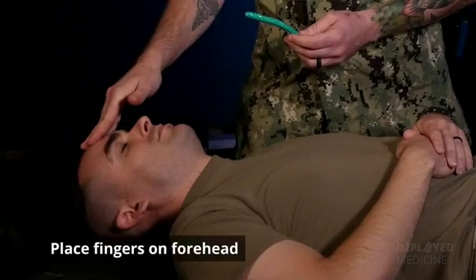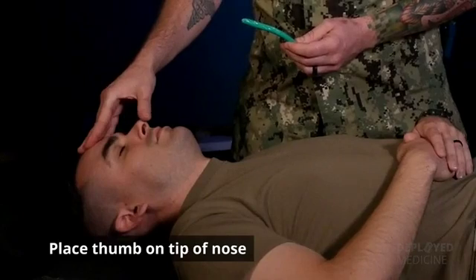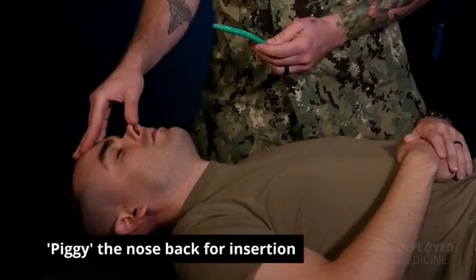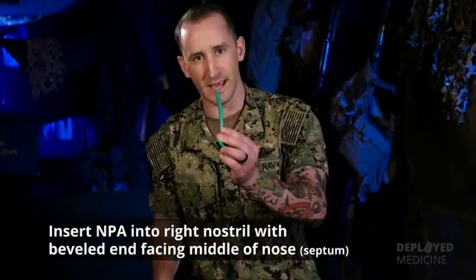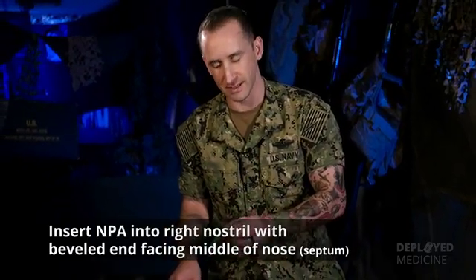Take the fingers of your hand and place them on the casualty's forehead, then take your thumb and place it on the casualty's nose tip. Perform what's called the piggy nose by pulling the patient's nose back. Ensure that the beveled end of the NPA is facing towards the patient's center nose line, or septum.